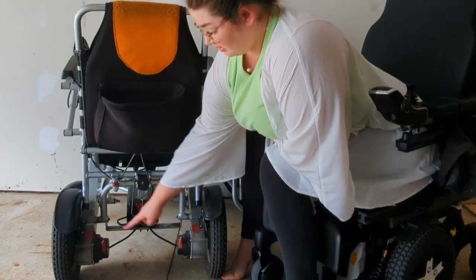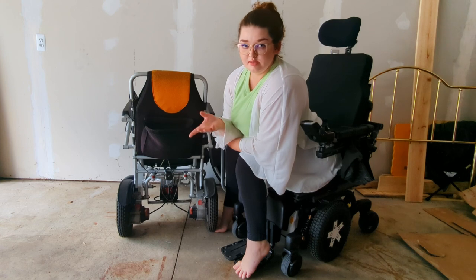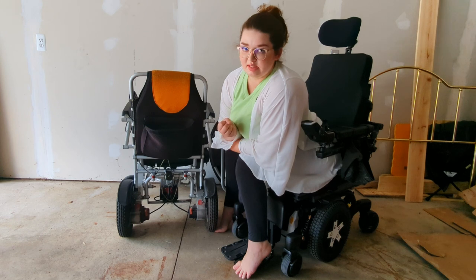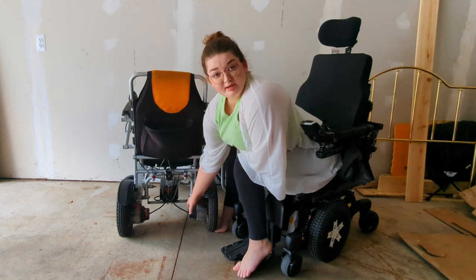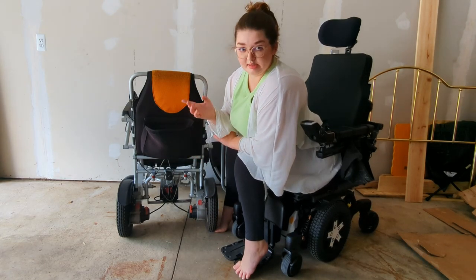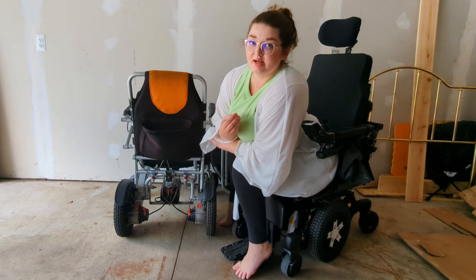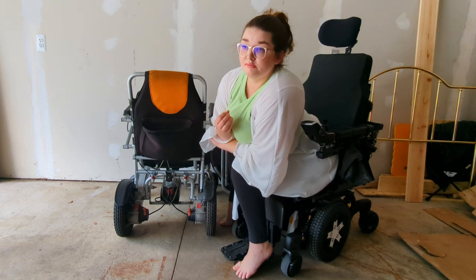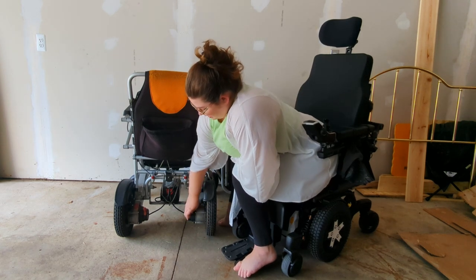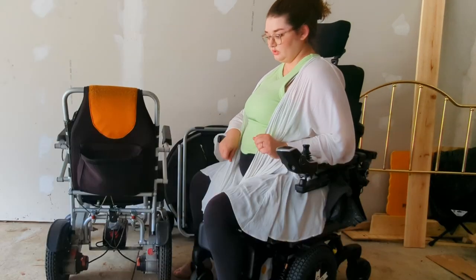These red handles here are the neutral brake locks — they're what flips the chair into neutral. When they're locked down, the motor is engaged and I can drive the chair around. But if they're flipped up, the controller blinks and I can't go anywhere — it's in neutral mode. So if the battery were to die and I needed to be pushed by someone, we'd flip it into neutral and they would push from the back. Then you flip them back down and I could drive the chair around again.